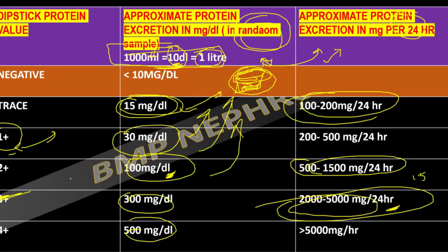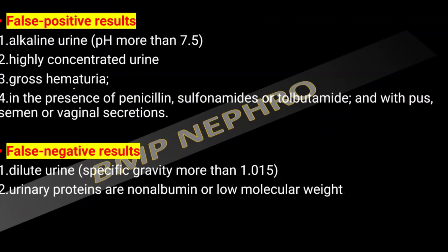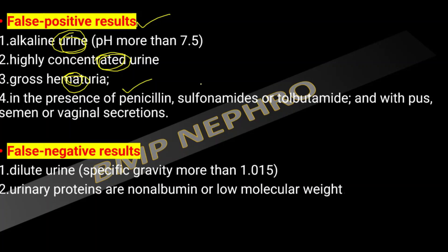The dipstick result purely depends on the amount of protein in the collected sample. If the urine is dilute, it may give a falsely negative result. Factors causing false positive results include highly alkaline urine, highly concentrated urine, and drugs such as penicillin, sulfonamides, and tolbutamide.